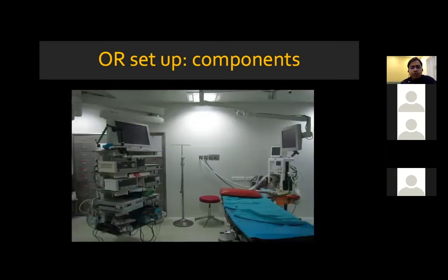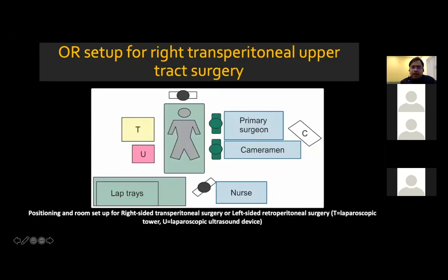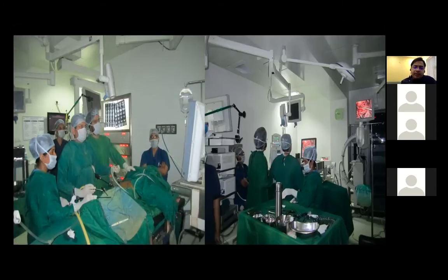Two screens opposite to each other are always welcome. And if you look at the real-time scenario, if you're doing a left-sided upper tract surgery, then the camera driver stands cranial to the operating surgeon, and the chief scrub technician stands caudal to the operating surgeon.